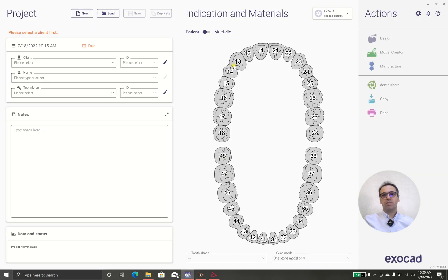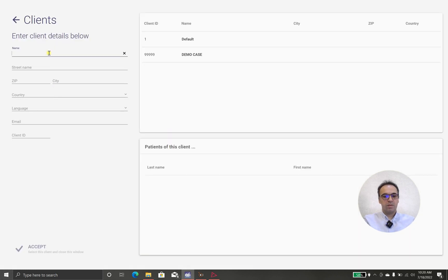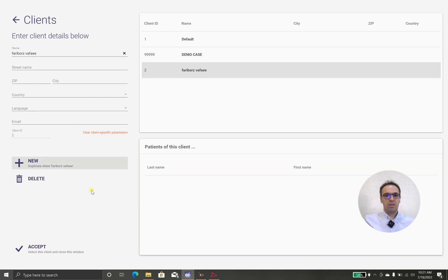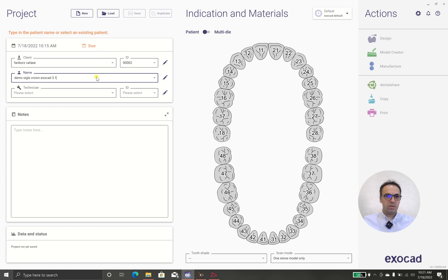This is Exocad 3.1. First of all, we need a client. I add the client — myself. We can add other things but it's not necessary. The name is 'demo single crown Exocad 3.1', and the technician is, of course, myself.